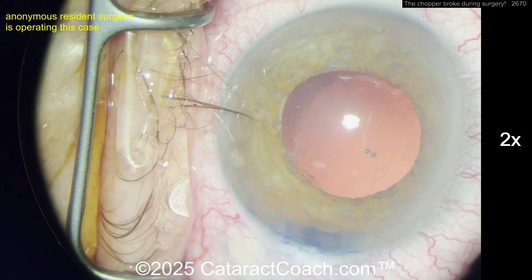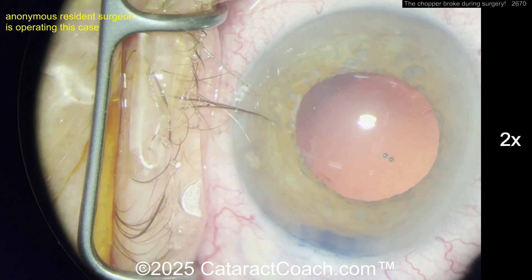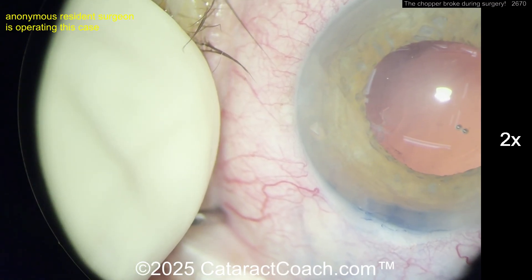I'd bring it centrally — actually bring it centrally with a big wave of viscoelastic. That's probably your best bet: push that piece around, maybe encapsulated in viscoelastic, and then grab it with some sort of forceps. If you don't have micro forceps, you can certainly just use your capsulorrhexis forceps.